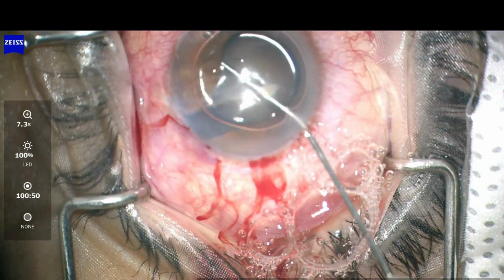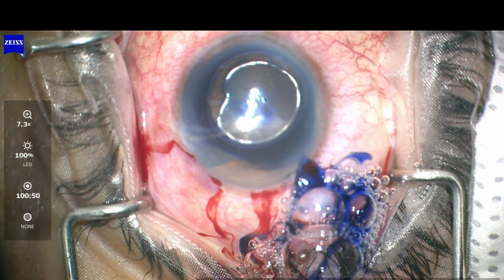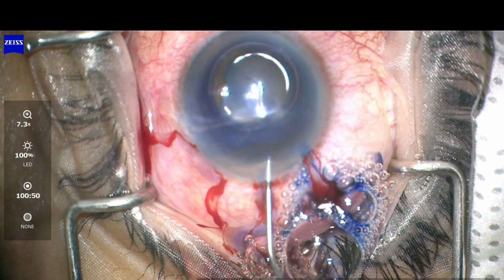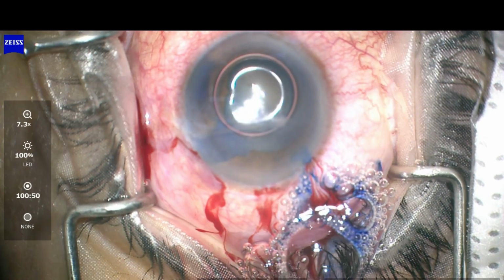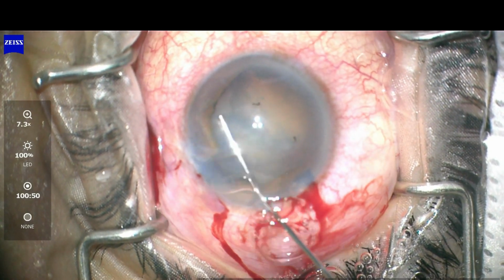Intracameral adrenaline is being injected and Xylocaine is being released. Anterior capsule is being stained with trypan blue dye. It is being washed off and replaced with viscoelastic substance.